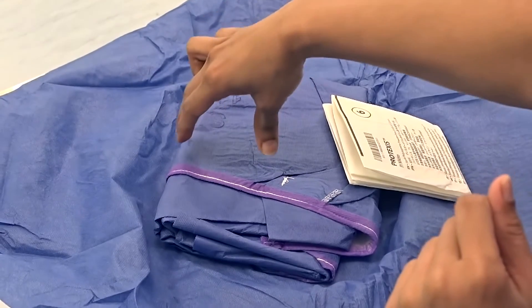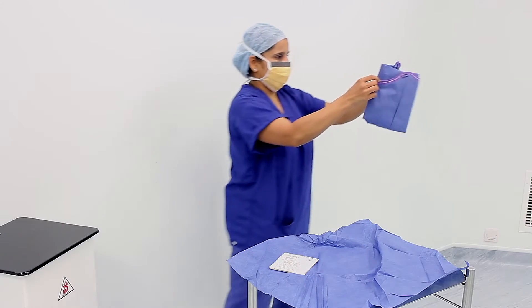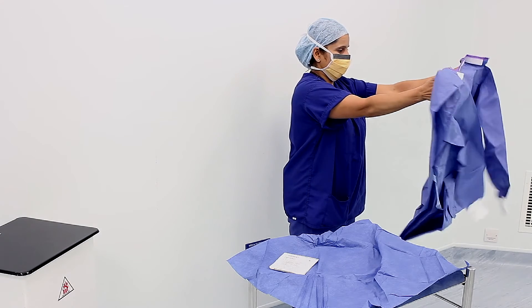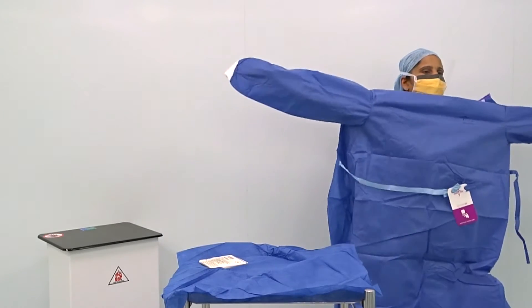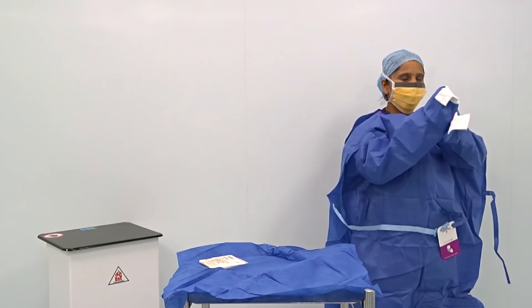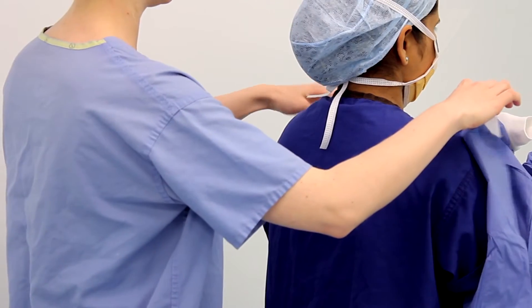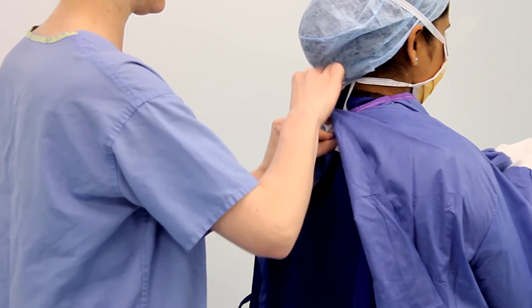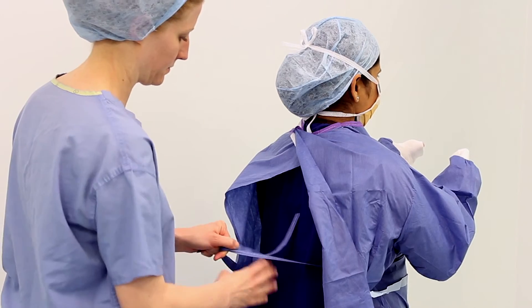Once the hands are dry, we can then pick up the surgical gown. We do this by using a pincer grip and holding it on the inner surface of the neckline. Holding the gown in two hands, we then let it unravel completely, making sure that as it does, it does not come into contact with any non-sterile surfaces. We then insert our arms into the armholes of the gown. However, we must keep our arms in the sleeve with bunching of the fist to prevent the hands from emerging from the ends of the sleeve. An assistant then ties the gown from behind, whilst we keep our hands and arms close together and at chest height, to prevent them from accidentally touching any non-sterile surfaces.